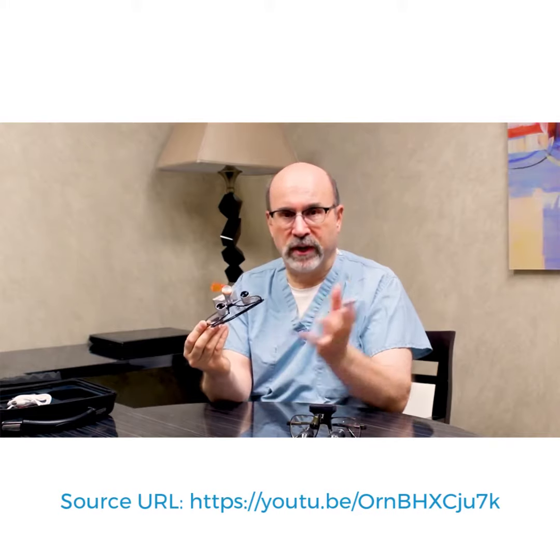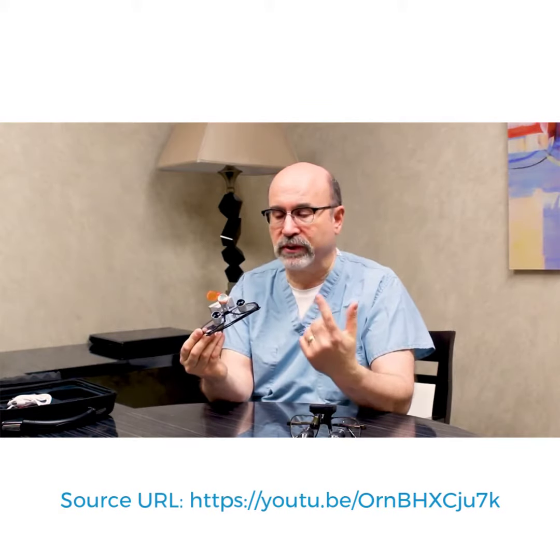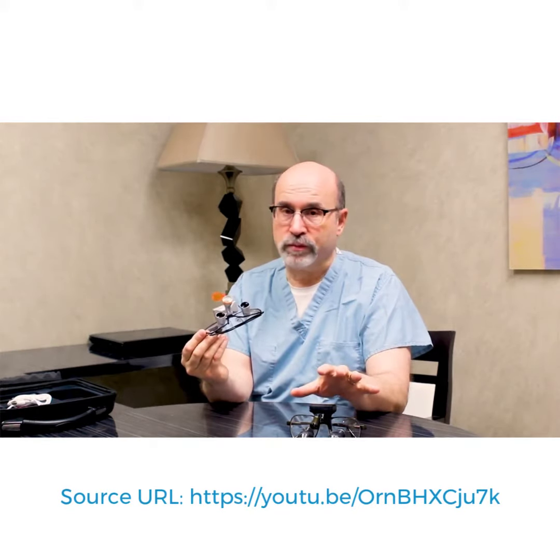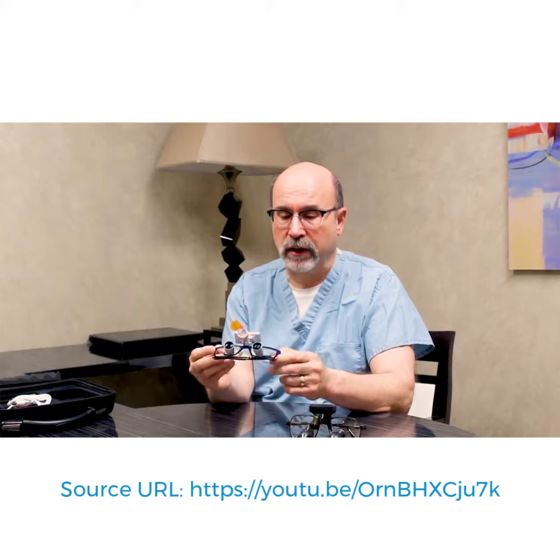The price point difference makes it a lot easier to have. Not only is it nice to have them in all my operatories, but the nicest part is having an extra pair — a spare pair. If your loops go down, we are so used to them, we're crutched on them almost. We have to have our loops. We don't feel like we can do dentistry without them. If you only have one pair of loops, you're up the creek. So the best thing to do is have a spare.